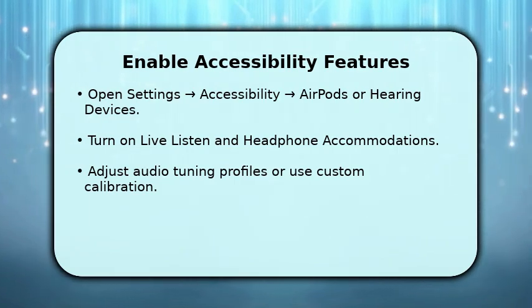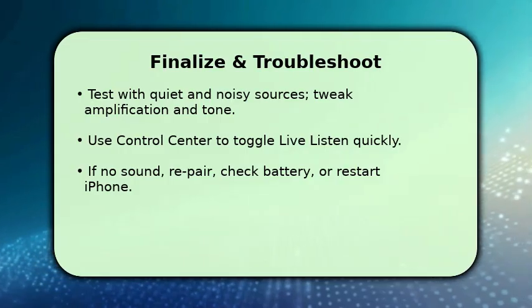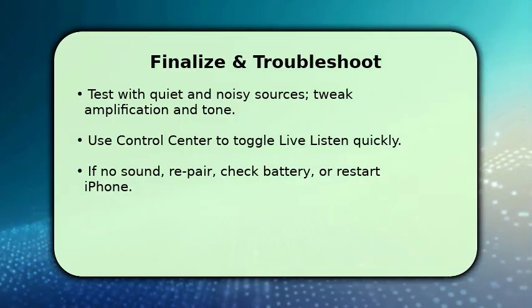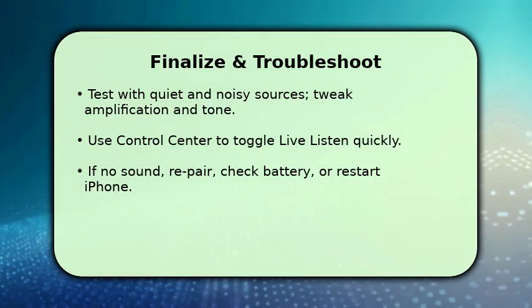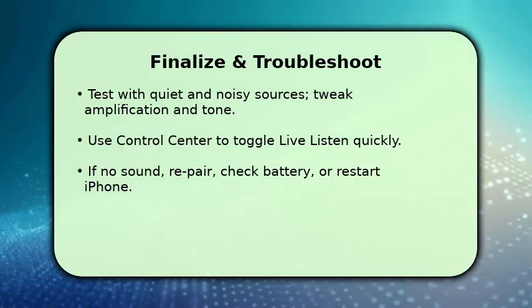Start live listen from Control Center and speak into the iPhone microphone to confirm sound reaches the AirPods. Adjust amplification and frequency shifts until speech sounds natural. Once comfortable, save settings and optionally add accessibility shortcut for one-tap access.